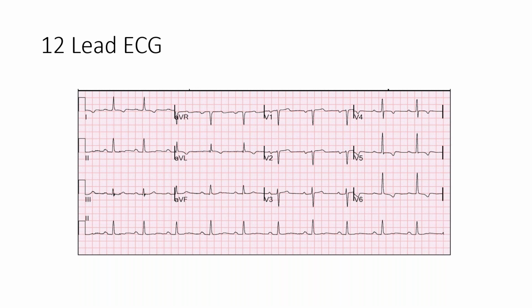Okay. Wow. I need to get with you after the class. So lead 2 at the bottom is just all lead 2. It's no other leads on there. See if I can get this to click.